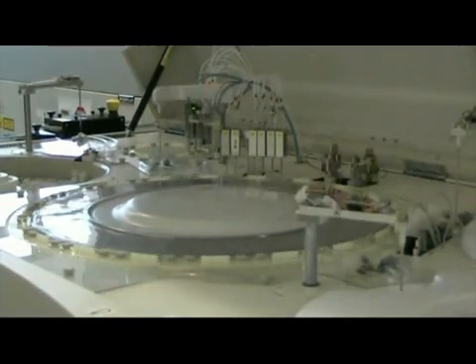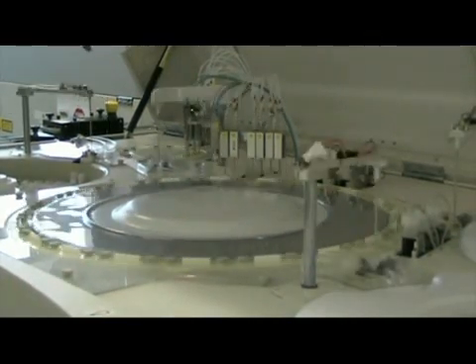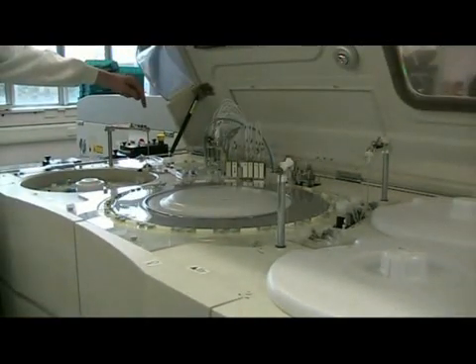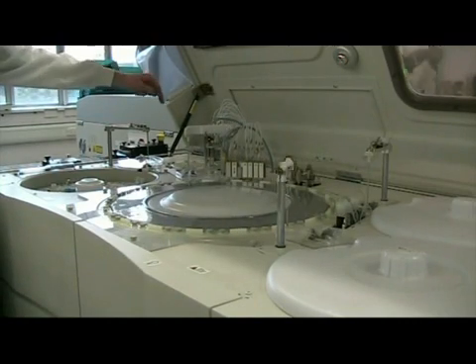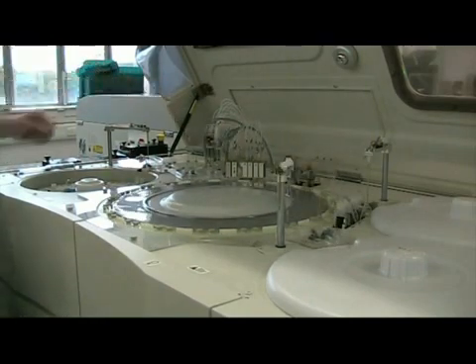It then puts an aliquot into that dilution turntable at the back, makes a one-in-five dilution of that sample with saline, and then takes separate aliquots from the dilution turntable and puts those into a sample turntable. You can see the probe moving the sample to the sample turntable.